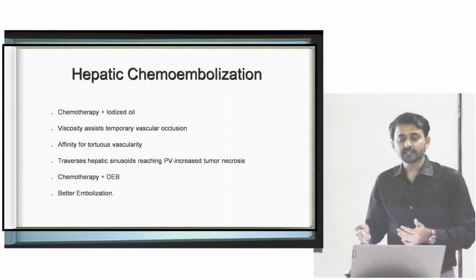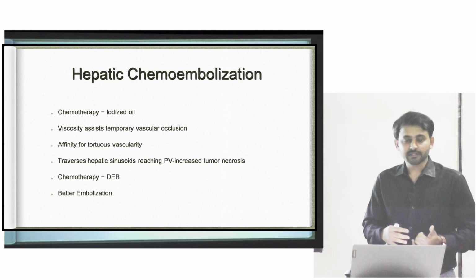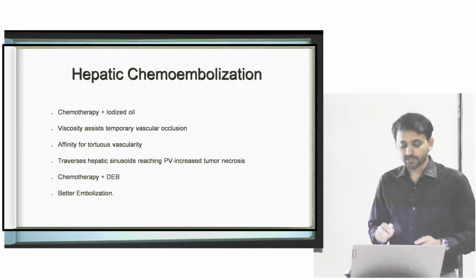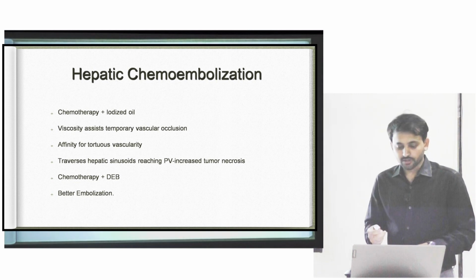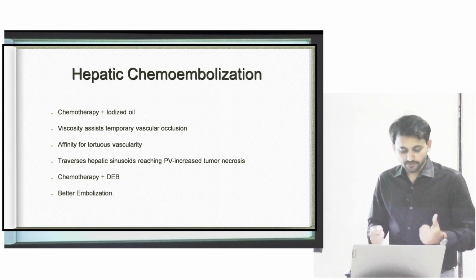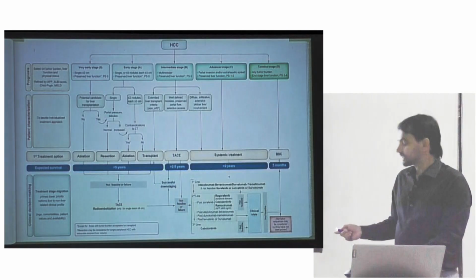And recently, combination therapy like TACE with ablation, or ablation with TACE, is giving very good results. So TACE is another common procedure, and we can do it here. We don't need to run to the metros for it now. So these are some case images again.